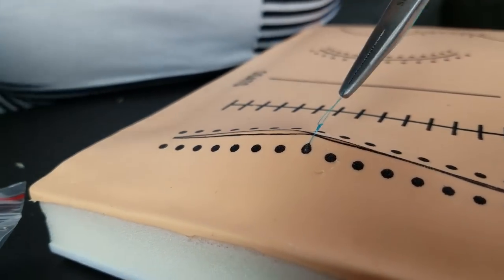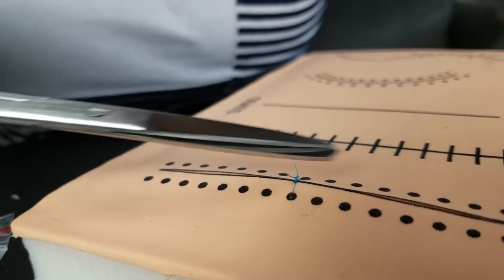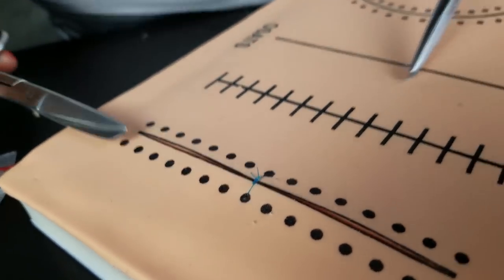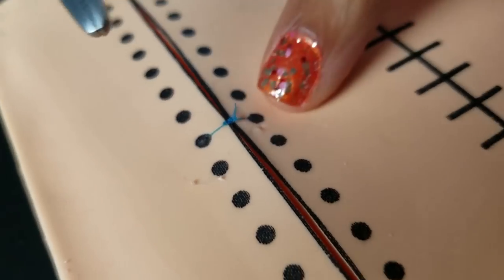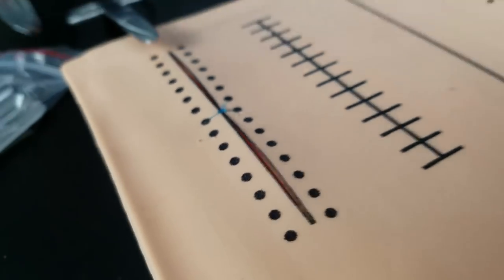So I'll get my handy dandy scissors and I'll cut it right there. All right, and so that is my stitch. That's my first one. Let's do this again, because I had a little trouble right here. Like this right here, that little hole shouldn't be there. So let's do this again.